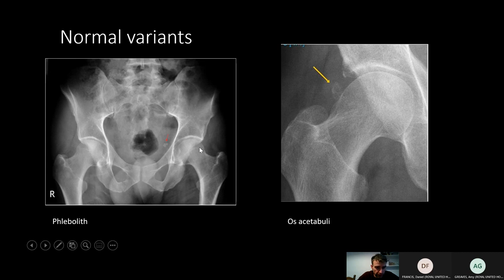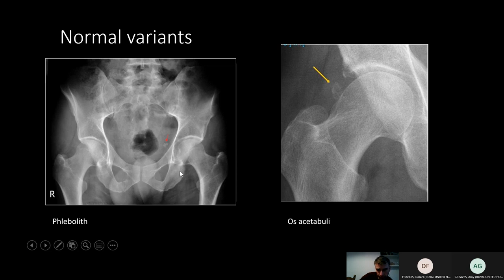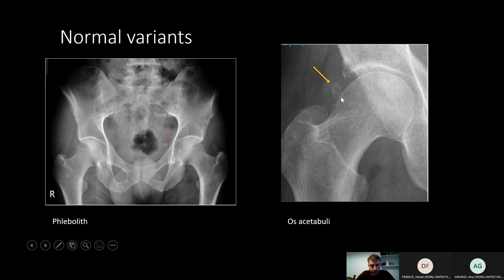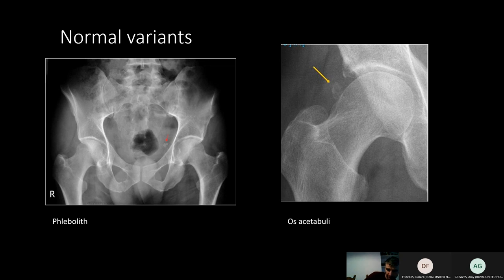A couple of normal variants: phleboliths are calcified lesions within the walls of veins within the pelvis, or calcified lymph nodes. Then there's the os acetabuli, which is almost like heterotopic ossification around the hip joint — a normal variant. It's not concerning because it's nicely corticated and doesn't look jagged like it's been fractured.